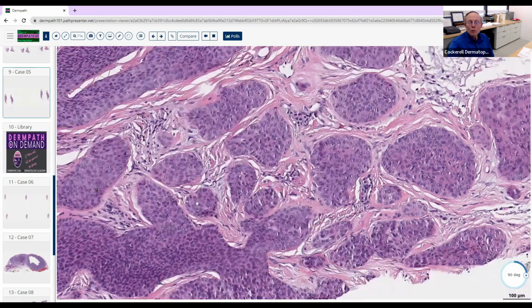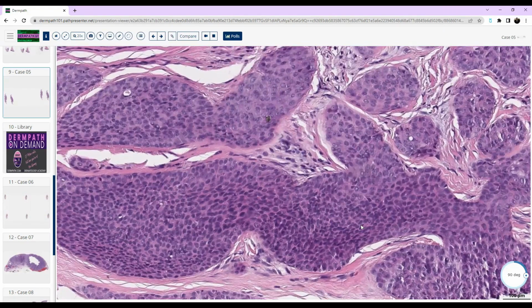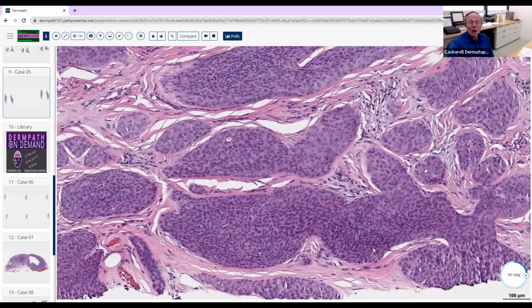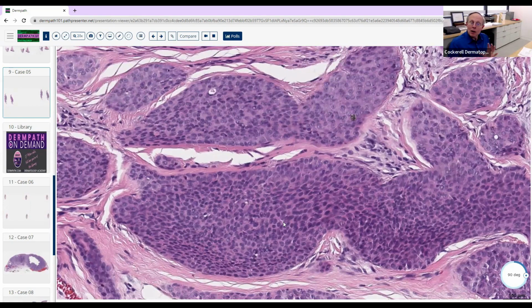So do you think this is follicular? It definitely could be. It was on my differential. Possible. What others could it be? Could it be eccrine or apocrine? Yes, it definitely could. Okay, so how do you tell those apart from one another? Which one's more common to have a duct with it? Follicle or non-follicle? Non-follicle. Non-follicle, good. So if you see something with ductal differentiation, like here, there is a duct there, you should think quickly, probably apocrine or eccrine, most likely.